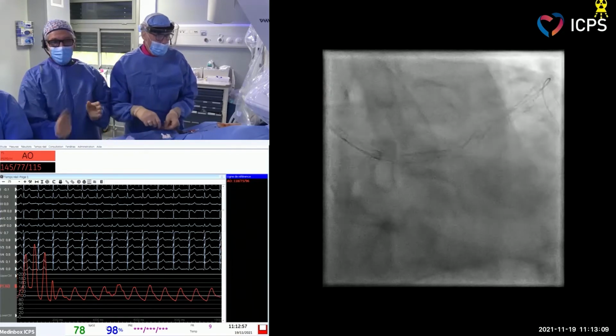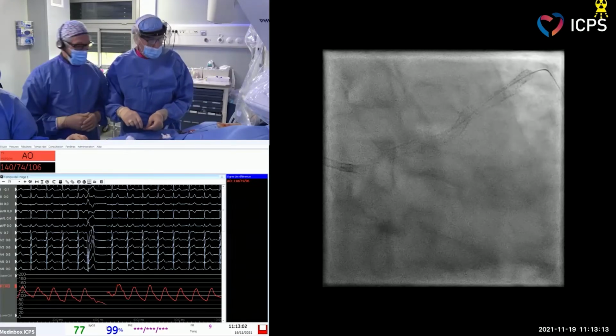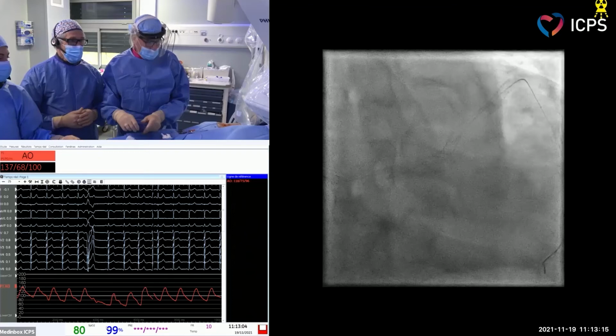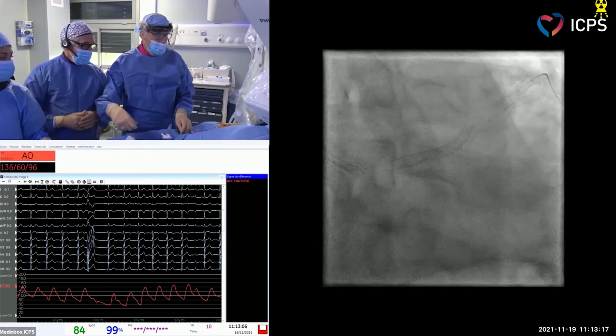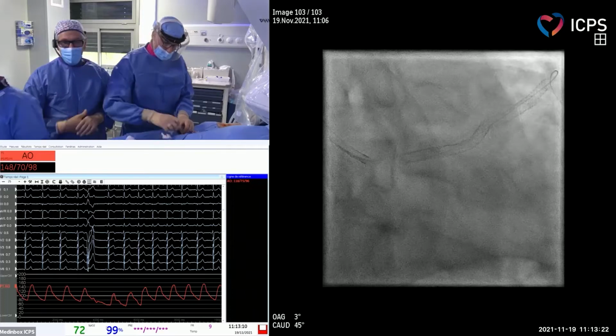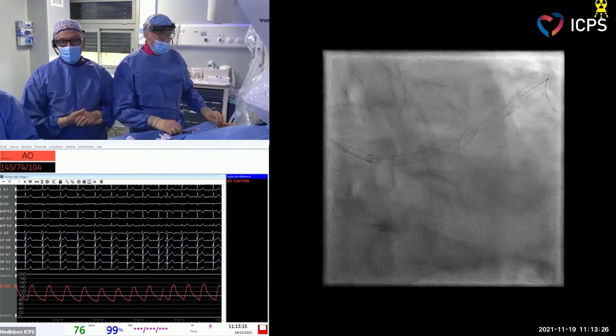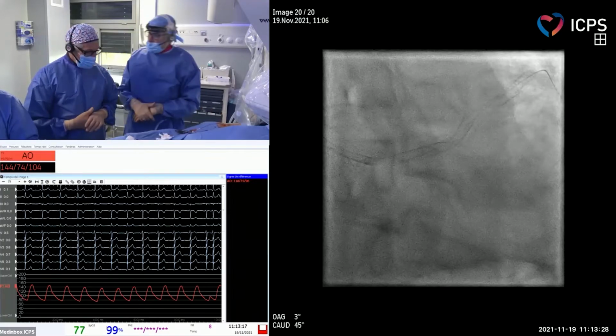So you will compress the ostium of the stent. This is a very important point. And we learned from the Excel study that when you have longitudinal compression, you double the risk of MACE at 3 years. Okay, so maybe we can perform the POT now, Thierry.